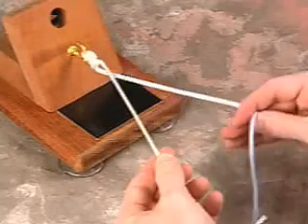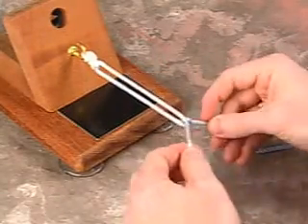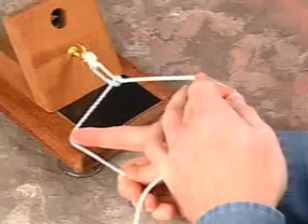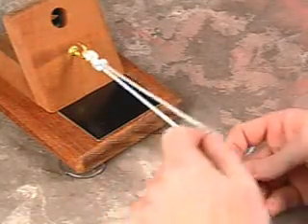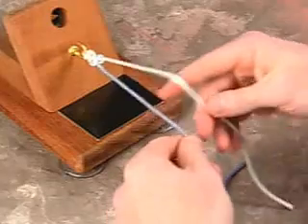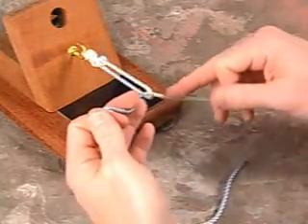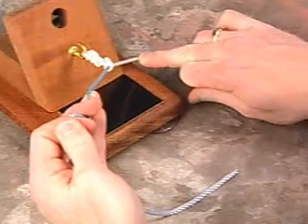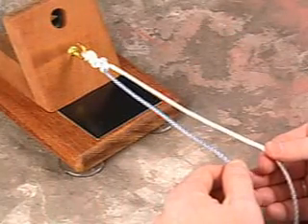We now switch to the new post, doing an alternating overhand throw from the last underhand, sliding this into the joint. The posts are again switched, and an overhand throw is done, this being slid into the joint as an alternating half hitch from the last.